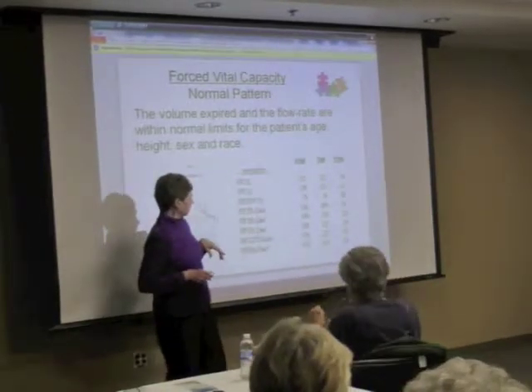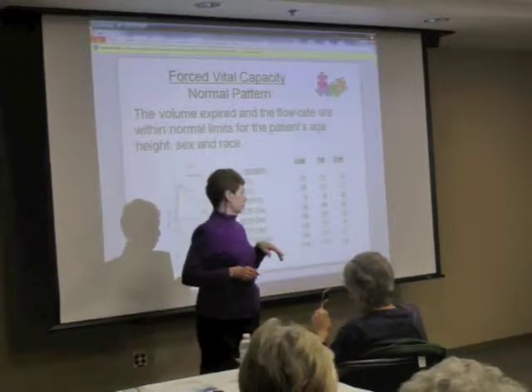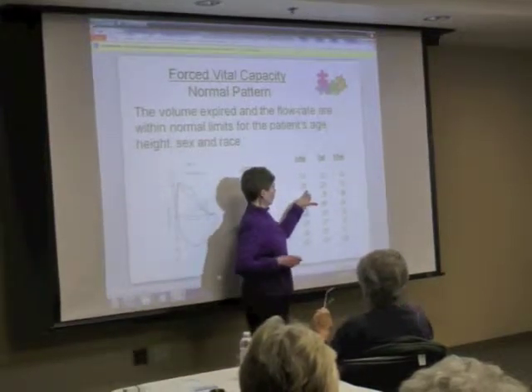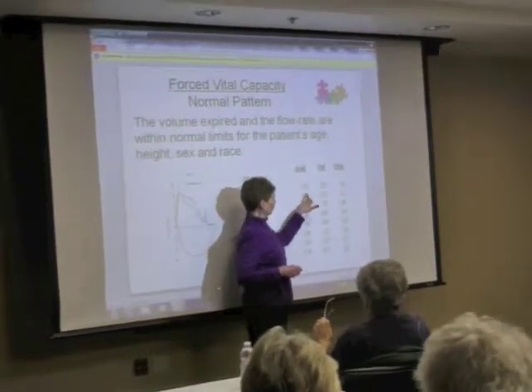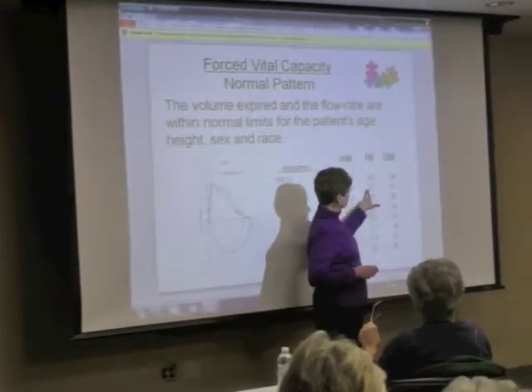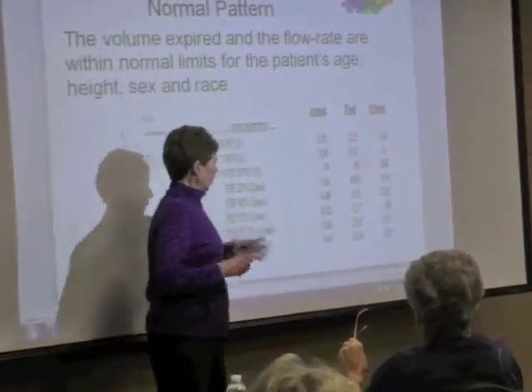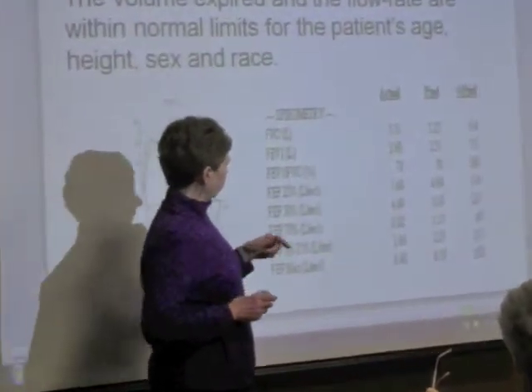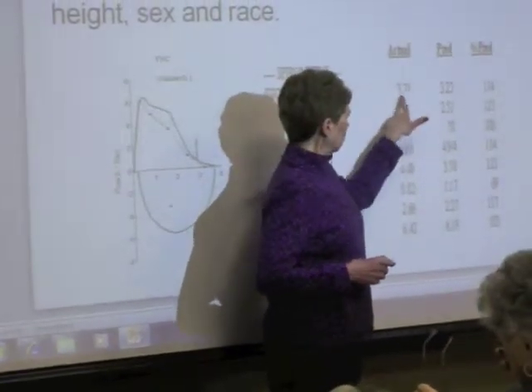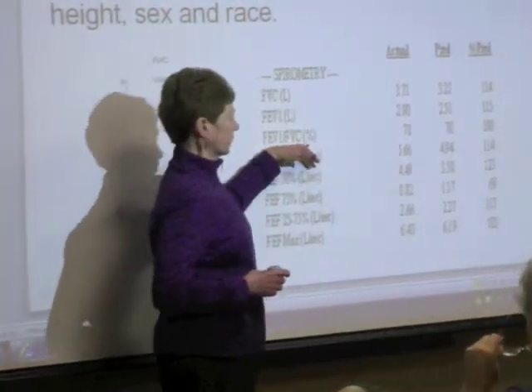The other number the doctor looks at very carefully is the volume of air you get out that very first second you blow. I actually blew out 2.9 liters of that total volume that very first second I started to blow. This is what was predicted, still at 115% of predicted. And the other valuable number we look at, it's going to compare the total amount of air that I blow out to the very first second that I started to blow. And that's this number here, this ratio.